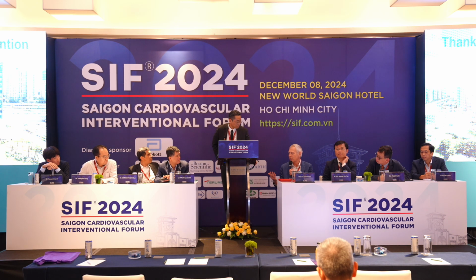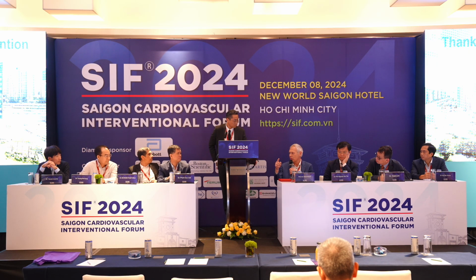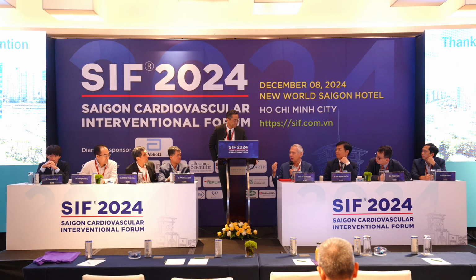Yeah. I fully agree. Basically, before IVL, we did it too. We call this rota stent, and we really have to upsize, because you can measure your MLA and you will see that the 1.5 will not cross. We had cases where the 1.5 doesn't cross. You have to go to 1.25 and then really step up. It's safer, and probably the rota stent effect is more effective when you upsize with different burrs. Yeah. I think you agree, yeah?